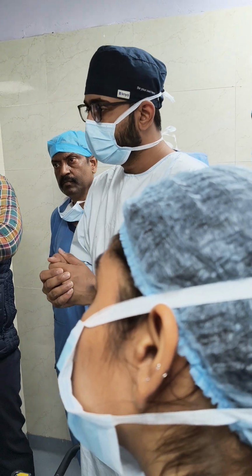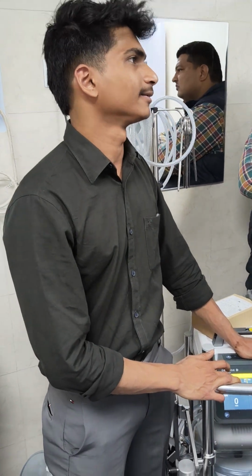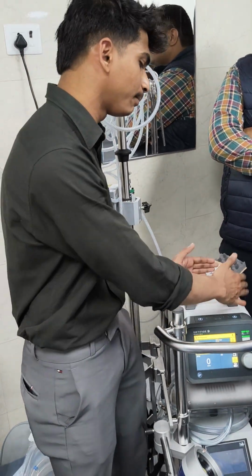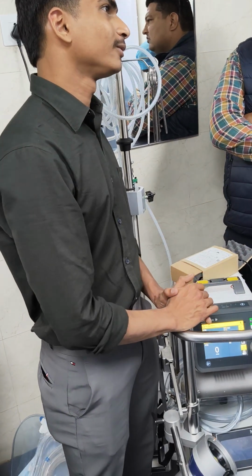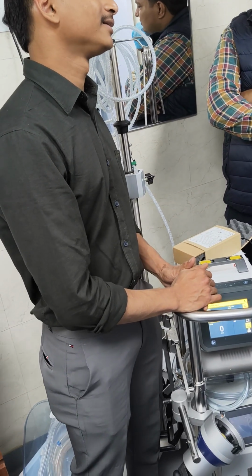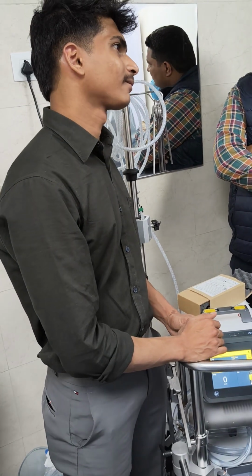The interventions are mainly based on the flow, liters per minute. So for the interventions we are only adjusting the RPM, but the pump detects the flow. That is the manual thing. This is the automatic console, supposed to have that capacity. So I'm titrating, and I have to think of the flow or I have to think of the RPM.